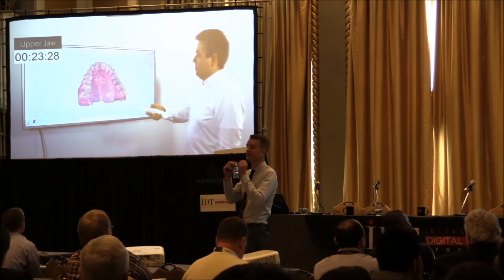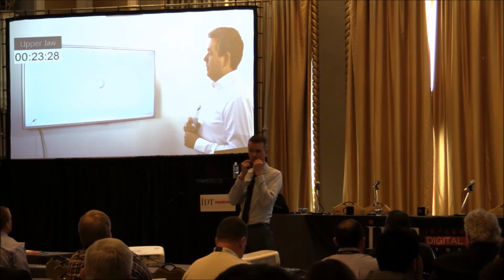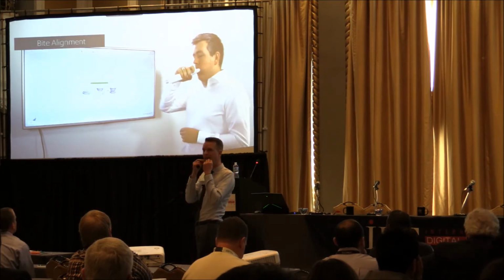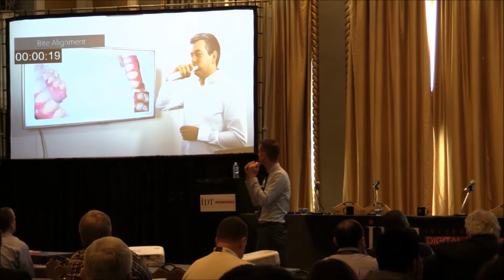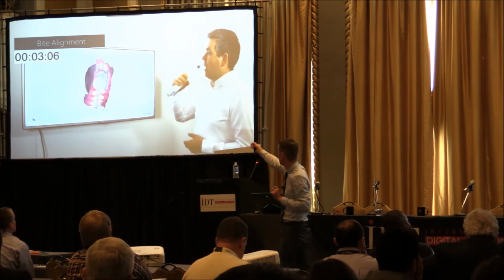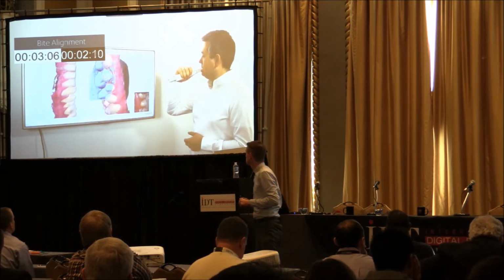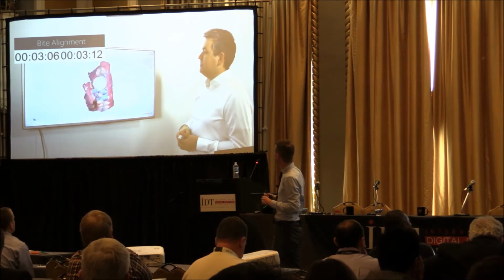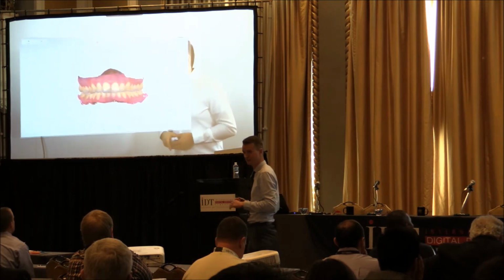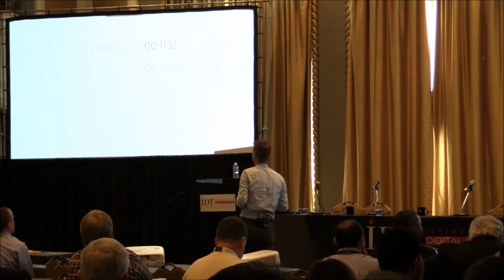It's hard to scan the lower edentulous today, because we haven't done our homework and optimized the software for scanning edentulous, and because you have so much soft tissue down there. All scanners work the same way. You scan the upper, you scan the lower, you scan the bite. Some scanners have 2 bites, others have 1 bite. This is where we are today with the cutting edge technology, and it is not bleeding anymore. It was bleeding some years ago. Also the 3D scanner was bleeding, even physically, because our tip was hurting people. But you can see where we are today.